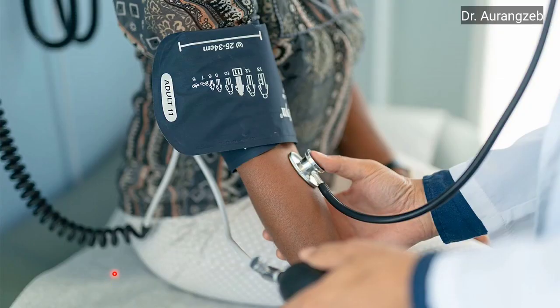This is how to measure blood pressure using an aneroid device. The patient is sitting comfortably, the cuff is at the level of the heart, the stethoscope is placed over the brachial artery so that we can hear the pulsation of the brachial artery. This is the bladder and this is the air release valve. These are the connectors, and somewhere here there is the manometer gauge.